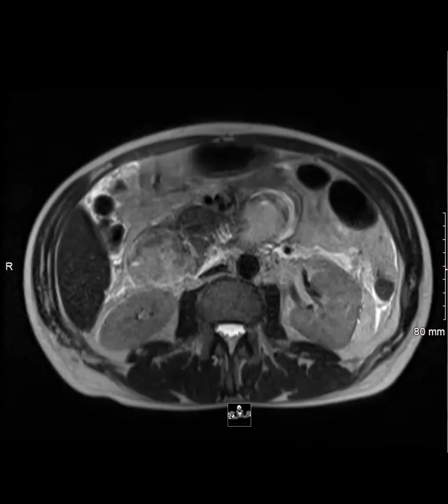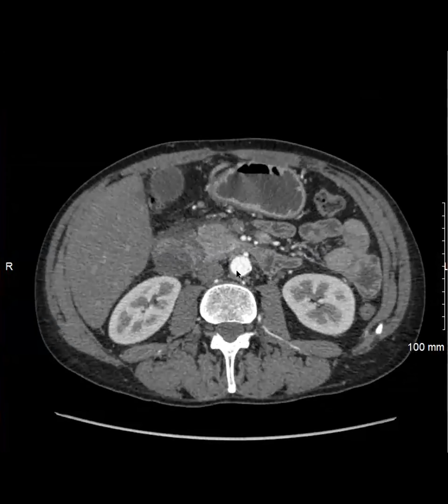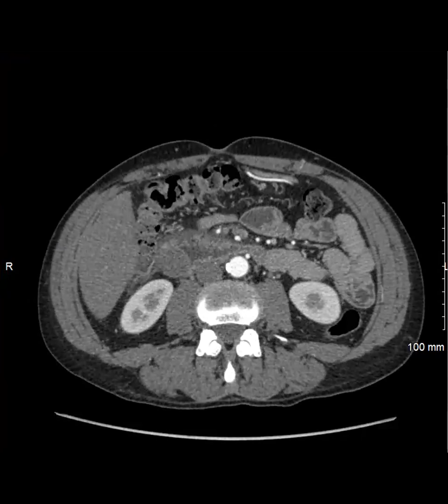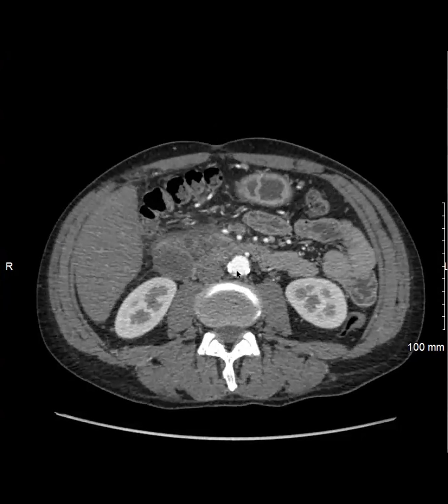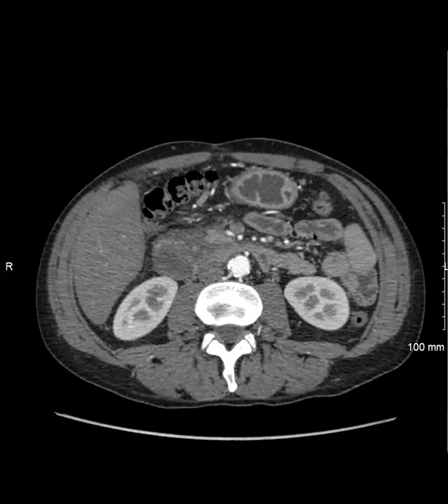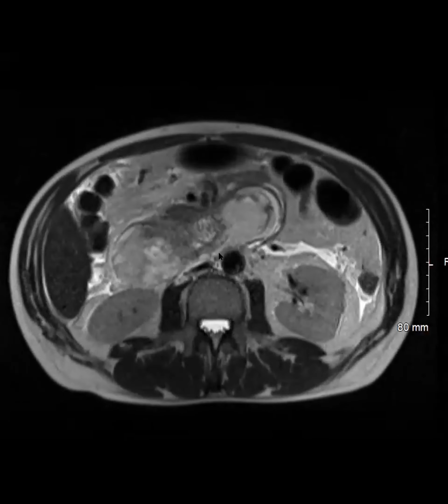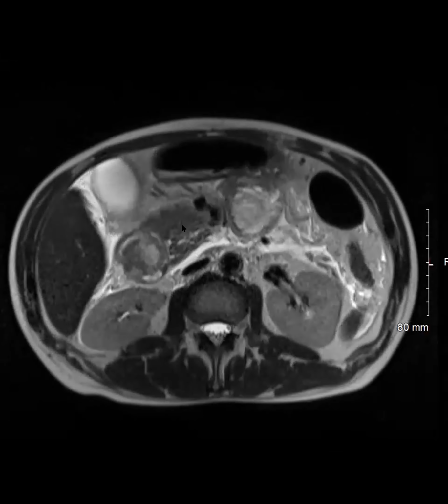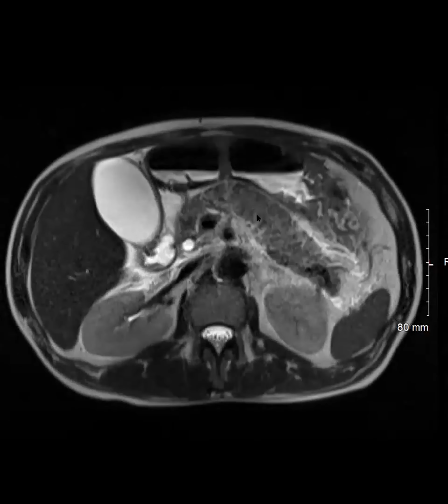All right, so this is an outside study. It's a younger gentleman who had, can you hear me okay? So he had acute pancreatitis. Now I don't know exactly why the next study was done, but he had an MR done the day after. So 1 day difference between the two studies. This is a very pretty example of interstitial edematous pancreatitis on the MR. You can see that the pancreas has abnormally high signal intensity. You see edema dispersed and all these things.